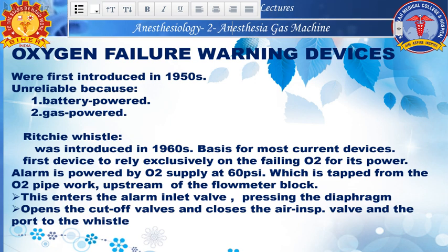Nowadays we have both visual and audio alarms, so that the technical persons and the anesthesiologist, everybody would be immediately warned, and they would take the necessary backup measures.